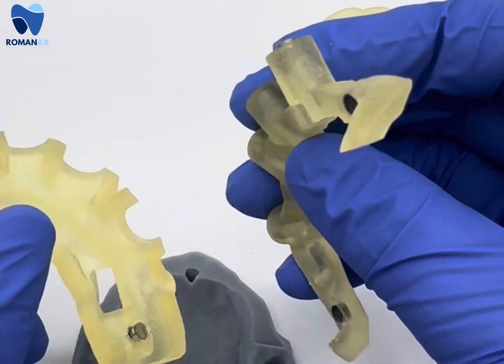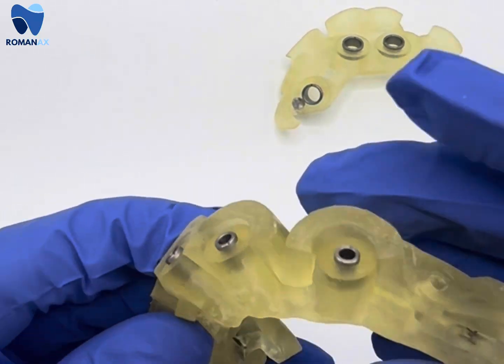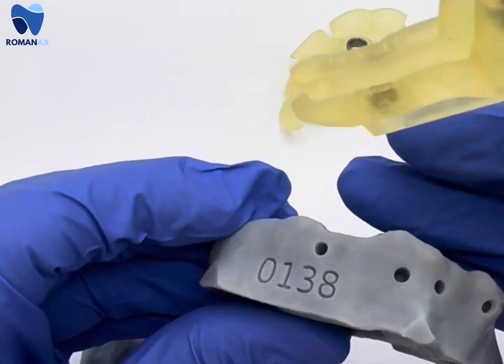Here you see the bone reduction, which has magnets allowing the interlocking of the pin guide and the bone reduction guide. The bone reduction guide has the actual metal sleeves in there for the stabilizing pins.